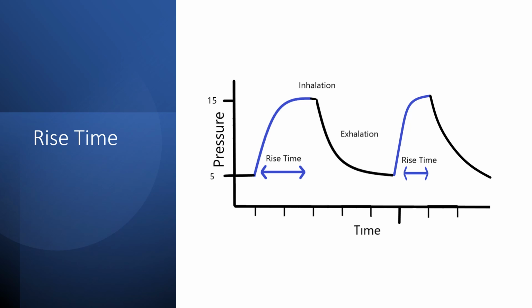And so if you shorten that, that's going to increase the speed that the breath is delivered, and it's going to match the patient's inspiratory breathing pattern. So there'll be less latency.